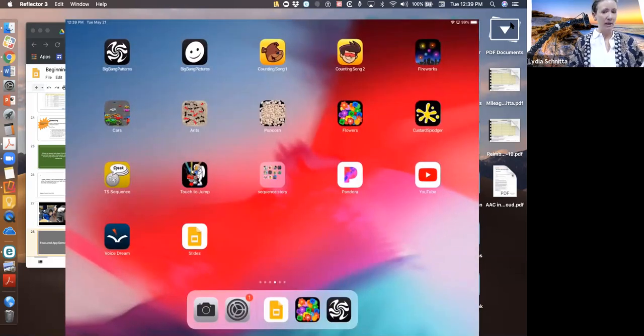All right. So level 2, zooming right along. We're going to keep doing all those same ones that we have up here. We're also going to add a second switch. And this switch is going to go to a voice output or a toy. It has to go to something not on the iPad. And this is just to teach that these 2 buttons do different things. The more different thing that they do, the better. So for this one, I have messages to, well, let's find out.